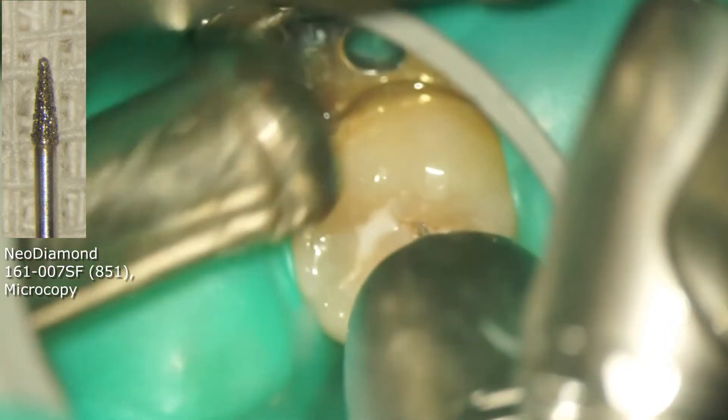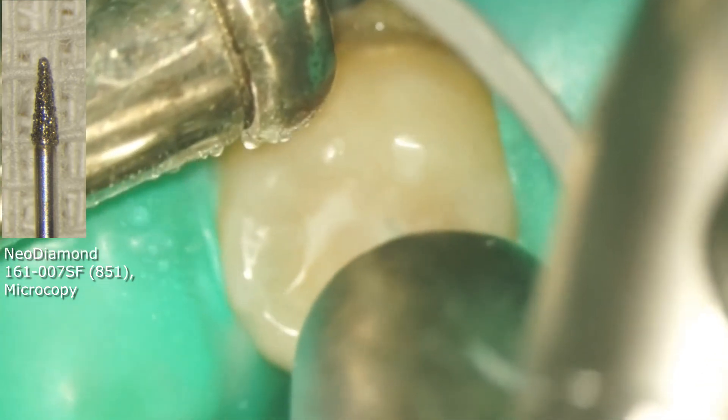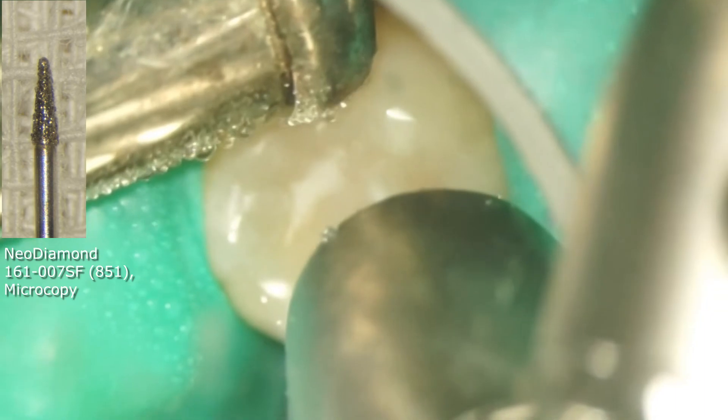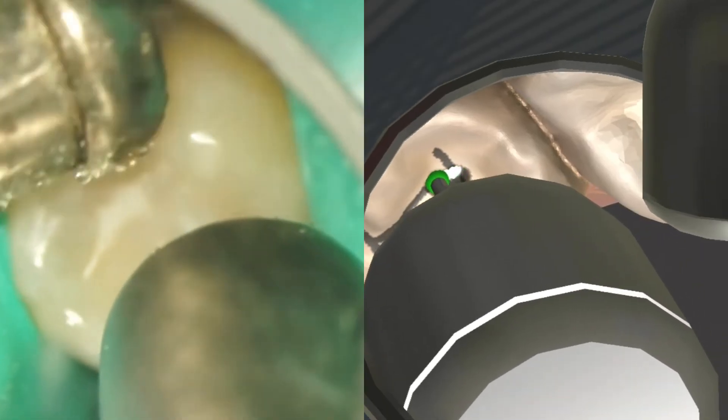This case is a fissurotomy of the left mandibular premolar. Operating on mandibular teeth with indirect vision is more complicated than the upper arch. For treating the lower arch, the cutting efficiency of the burr is essential.